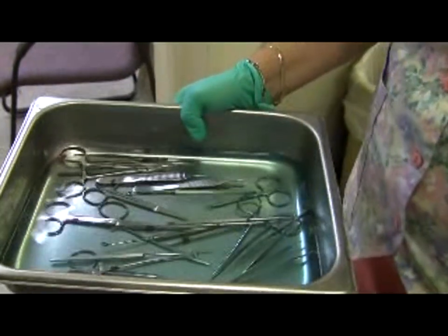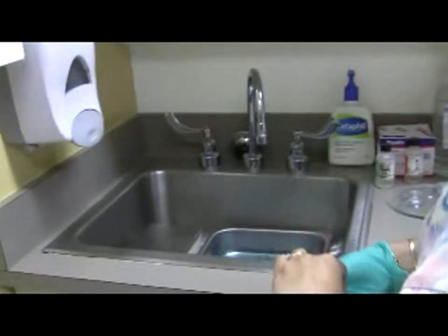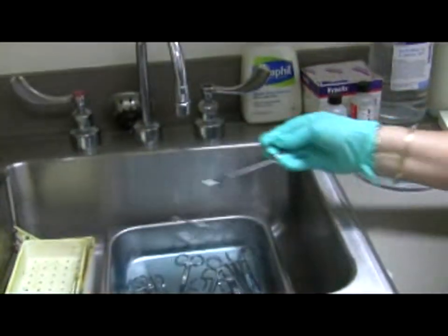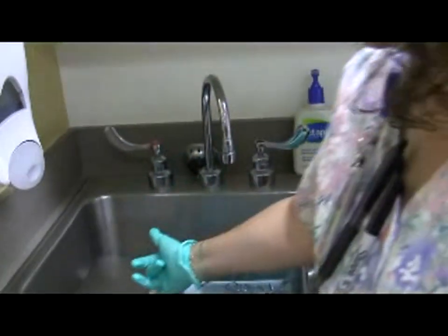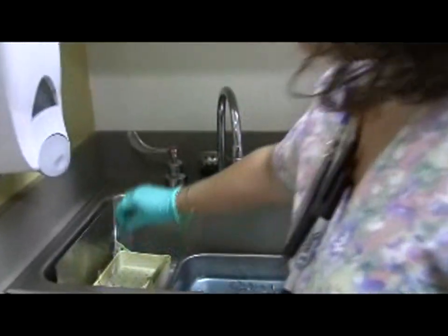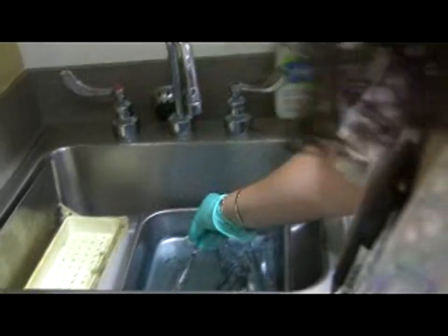There's an error here — the hinged instruments are not left open, so we need to correct that. All hinged instruments should be left open and dropped in so they are submerged in the SideX. In the morning when you come in, you pull up the tray, it rises, and you collect the instruments carefully so you don't get stuck.